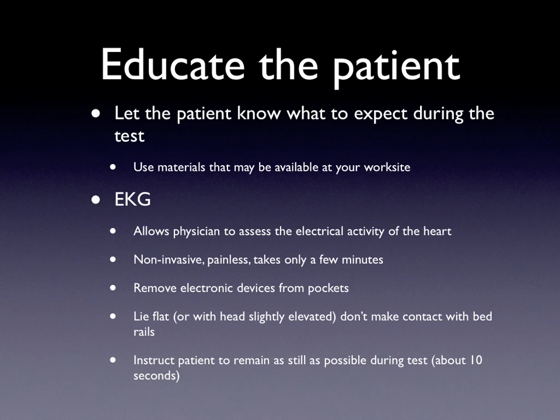Have the patient lie flat or with their head slightly elevated, and don't make contact with the bed rails. You've seen that before. Instruct the patient to remain as still as possible during the test, and for a 12-lead EKG, where it's taking a snapshot, that usually lasts only about 10 seconds. We're going to learn more about the 12-lead EKG machines and how they work later on in our course.